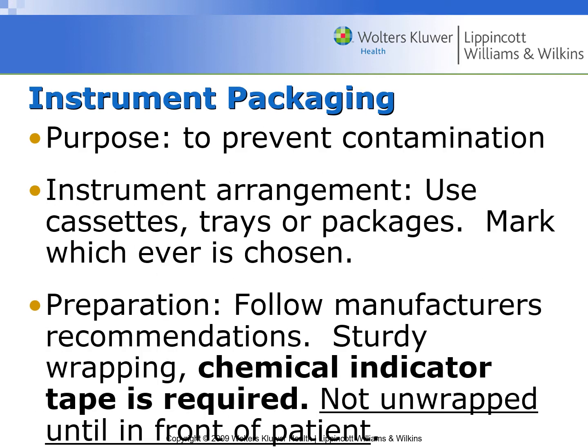Instrument packaging, the purpose is, of course, to prevent contamination. We arrange the instruments into a cassette. We put them in trays or packages. We mark whichever is chosen. So we always stamp a date on the back, so that we know when it was sterilized, and you put your name and number on them also.